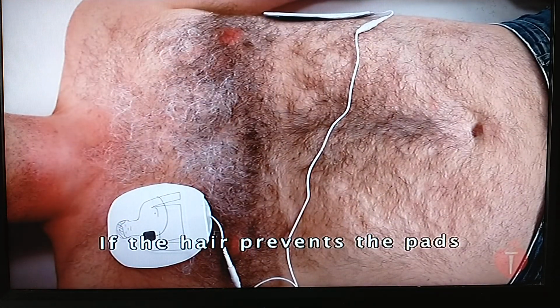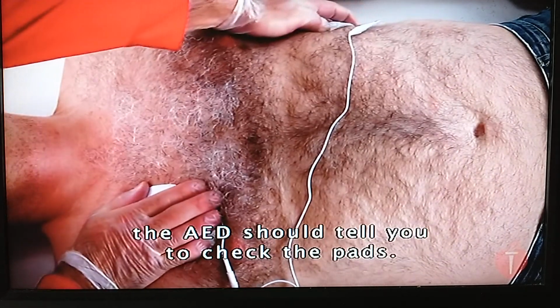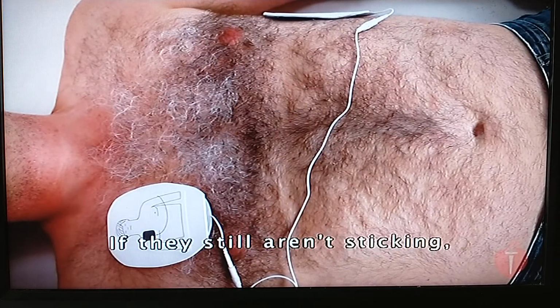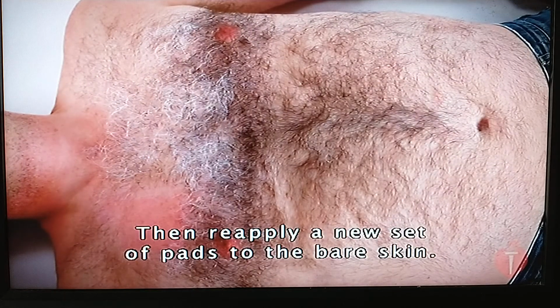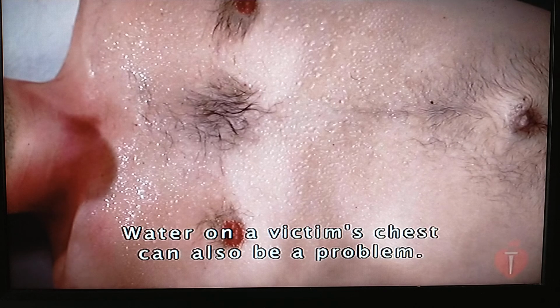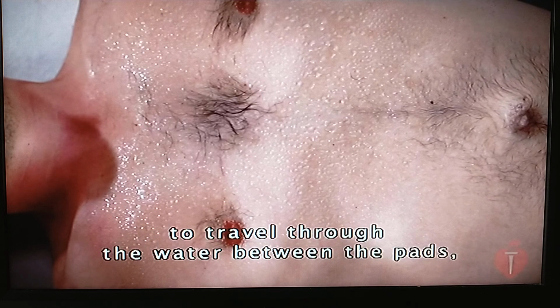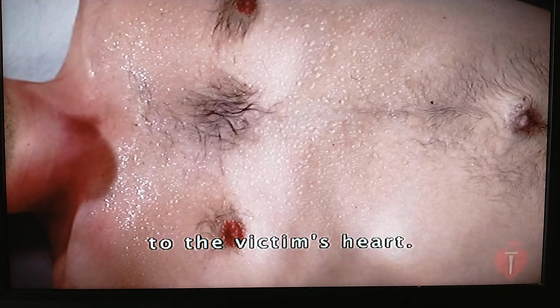If the hair prevents the pads from coming in contact with the chest, the AED should tell you to check the pads. If it does, press the pads down more firmly. If they still aren't sticking, rip the pads off forcefully, removing the chest hair. Then reapply a new set of pads to the bare skin. Water on a victim's chest can also be a problem. It could allow the shock to travel through the water between the pads, ultimately preventing delivery of an effective shock dose to the victim's heart.